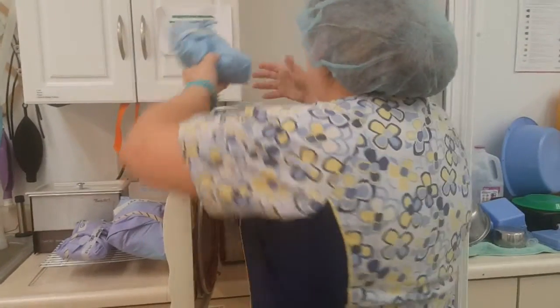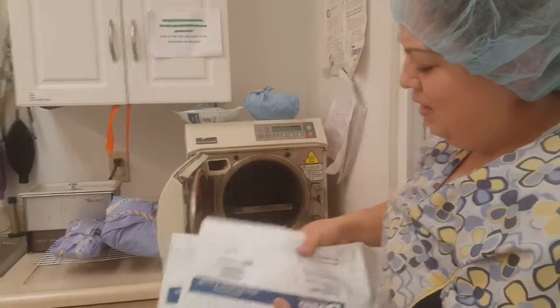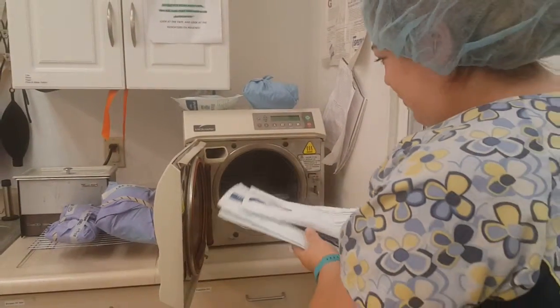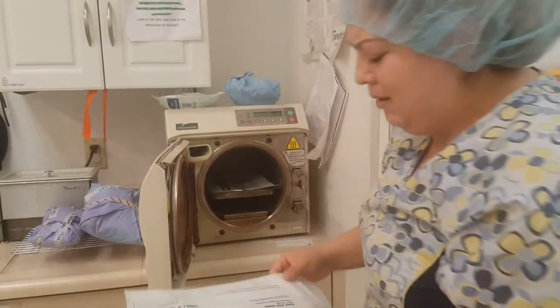Pouches you always want to lay with the paper side up. That way all the steam can go through properly and they can dry properly.